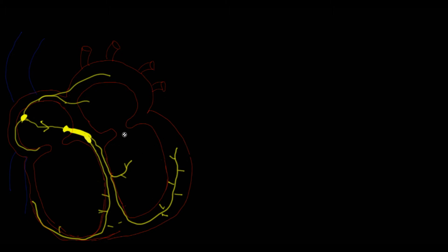So now we have an idea about how the pacemaker looks and the conduction system of the heart. Let's find out what the pacemaker exactly does. So a pacemaker in short is basically used to treat conduction heart problems. Conduction heart problems can happen anywhere in the conduction system.